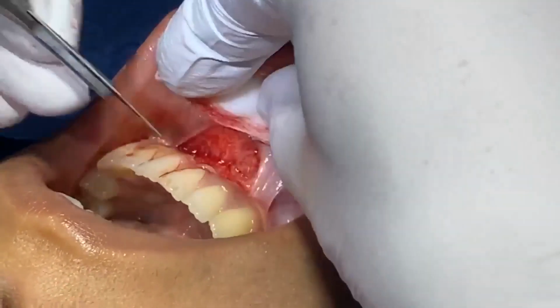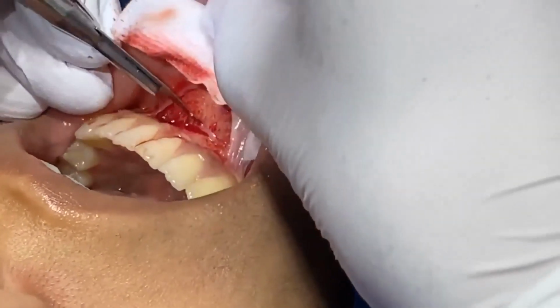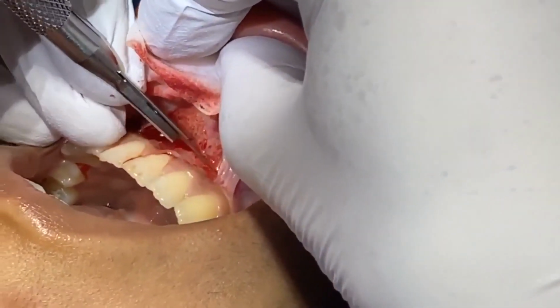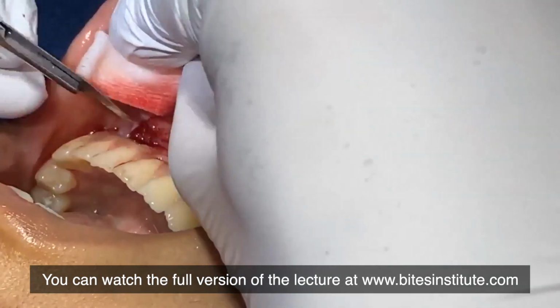So when you're doing a connective tissue graft, you can raise a full thickness flap and still have a very successful outcome. But with FGG, you do not want full thickness, okay? You need to leave enough periosteum attachment underneath it so that you can suture the graft to the periosteum.